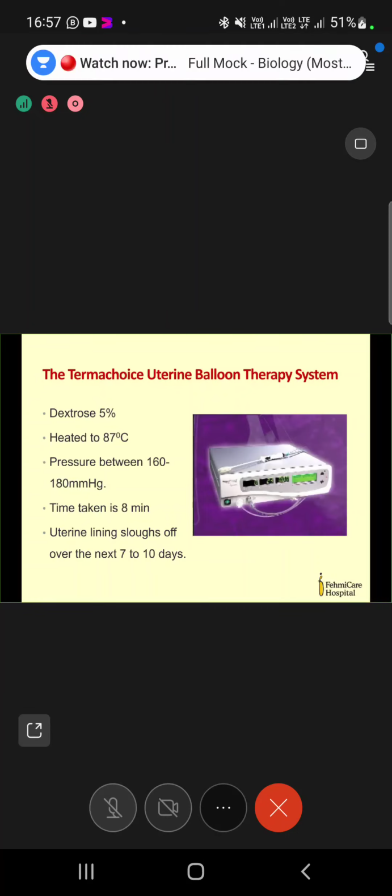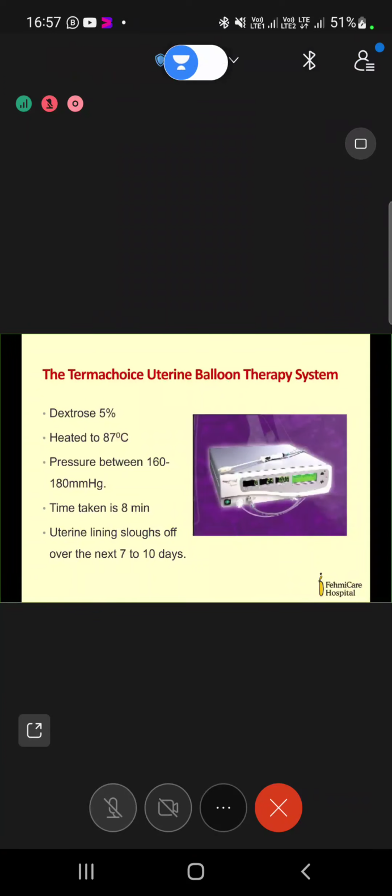computerized feedback. You have to just watch the monitor. A few practical tips: for this balloon, you have to insert the syringe first and withdraw if there is any air. Then, once the balloon collapses, gently insert the balloon into the uterocervical canal.